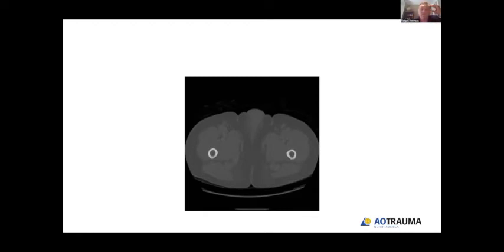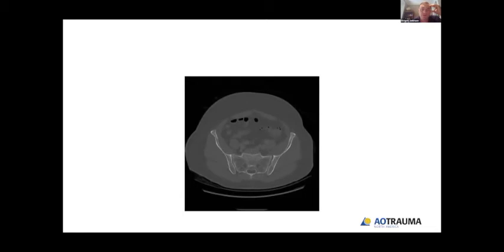So here's a few sort of isolated cuts. You can see the SI joint. Another thing to notice is this patient has quite favorable anatomy for iliosacral screws. He's a large patient, and he also has large corridors at S1 and S2. Perhaps there's a little vacuum phenomenon in the right SI joint, just to be aware of. Maybe there's something more there than the CT scan would suggest.